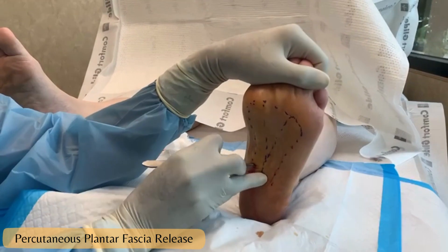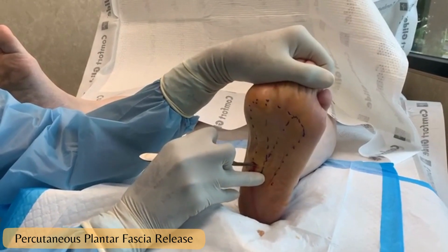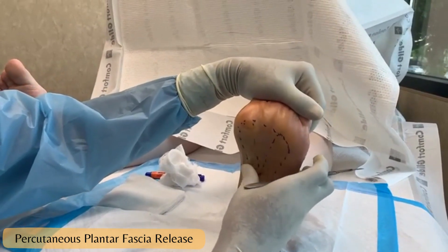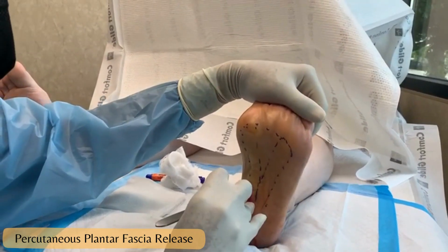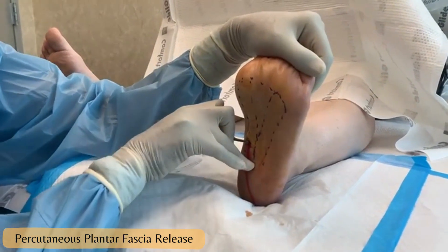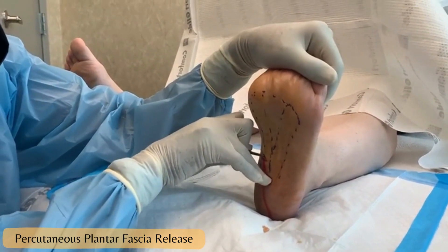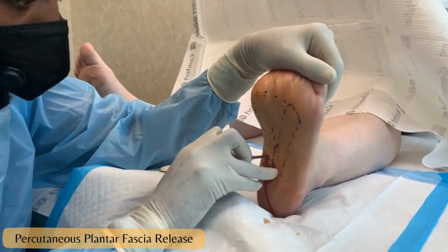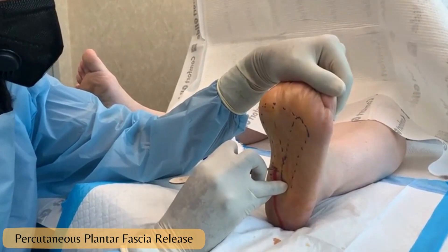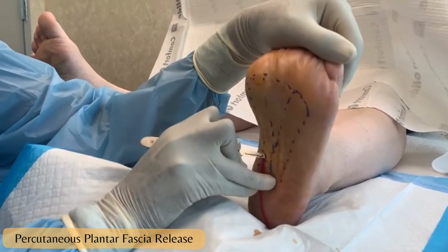It's nice and loose there. Let's check that — it's a little loose. Let's check and see if there are any more fibers. There's a quite thick band here; you can feel that as we go in. Almost through it.